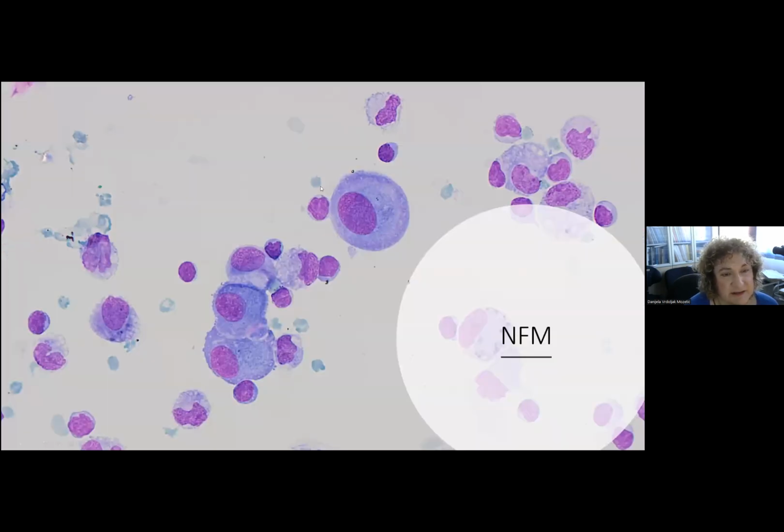Another picture you can appreciate here. You can see here a nice mesothelial cell with the oval nuclei, but regular nuclear membrane and basophilic cytoplasm. This is also negative for malignancy.